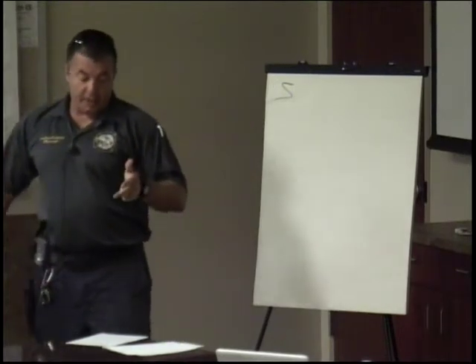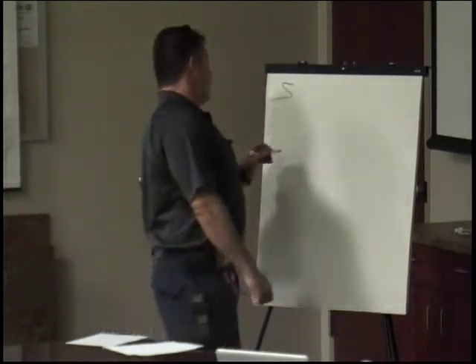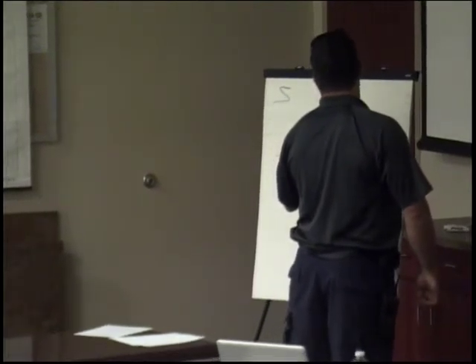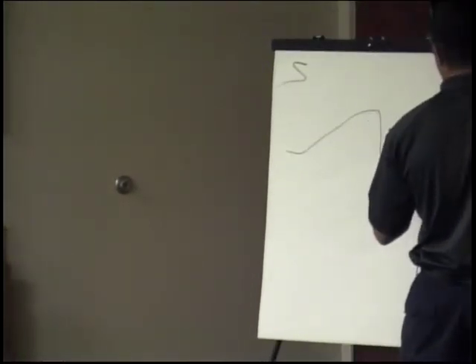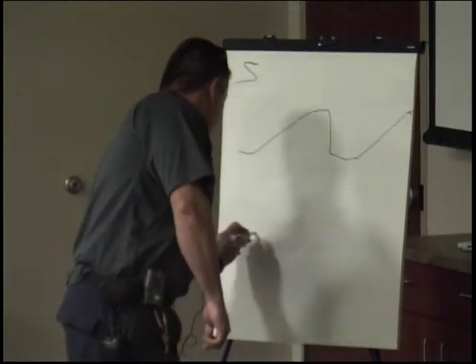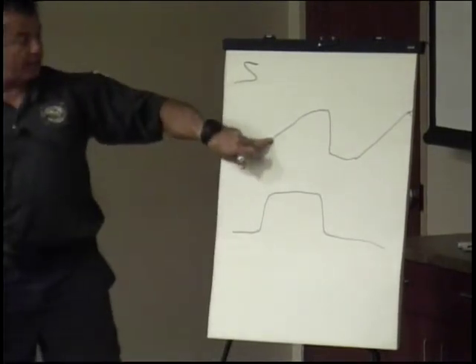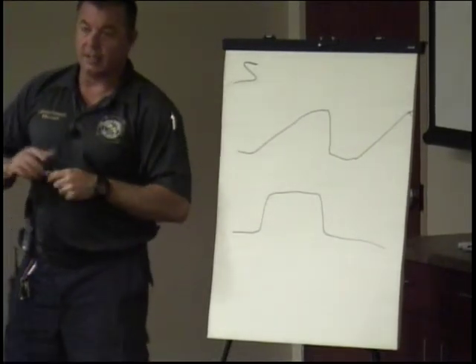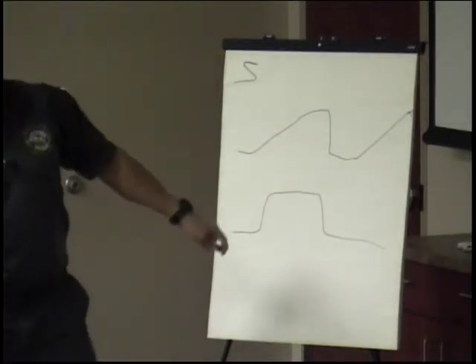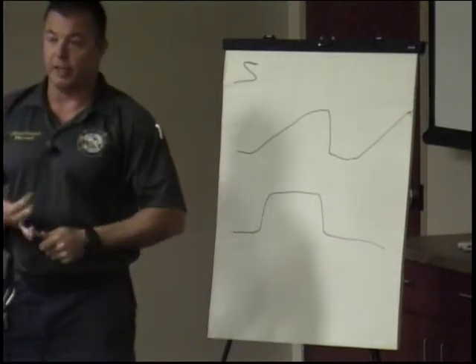Asthma, COPD, and CHF, you can use it in those. Bronchospasms, they call it a shark fin. It's just a slope. The shark fin, which we know the normal waveform looks like that. So the shark fin, that bronchospasm, they're having a hard time getting that air out. So they're getting the air in, but they're having a hard time getting it out. So if you see that shark fin, it's going to be an asthma patient, COPD patient.